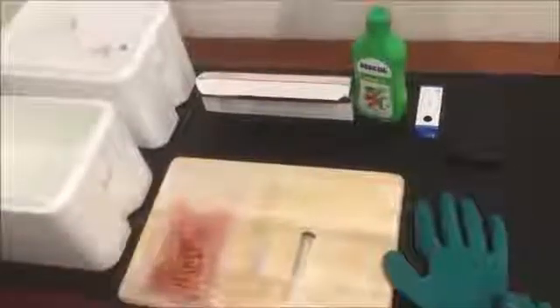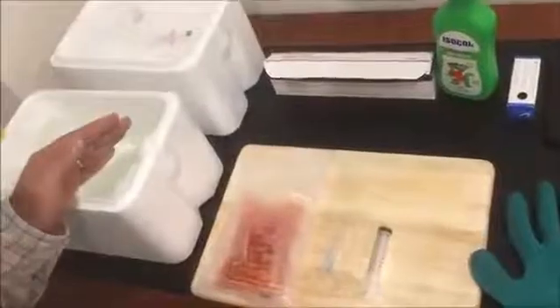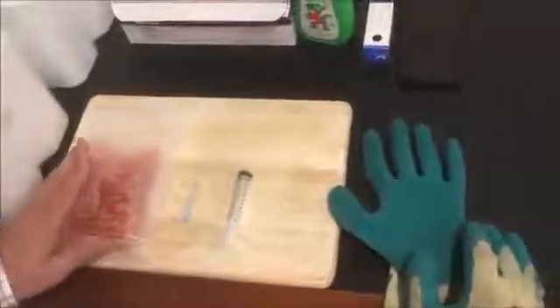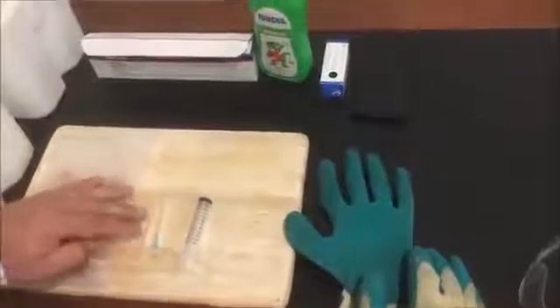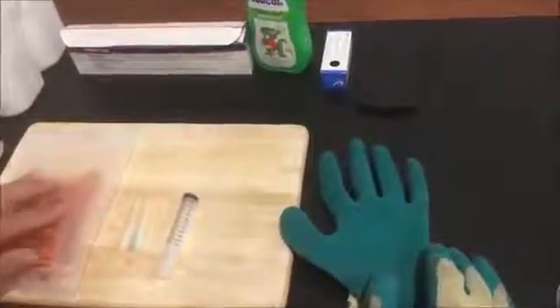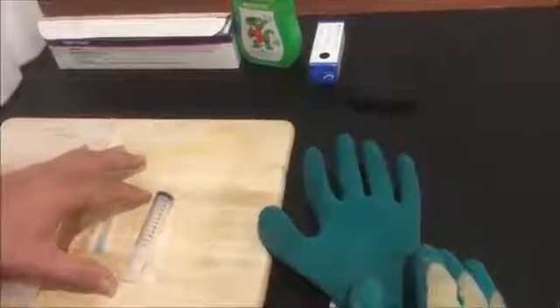Next, get everything prepared: the vaccine, a water bath at the correct temperature of 28 degrees with a way to measure it, the diluent pouch which is sterile inside the bag, needles to transfer the vaccine from the ampoule into the diluent, and an appropriate size syringe — this is a 10ml syringe.